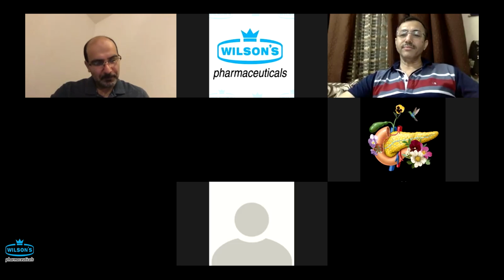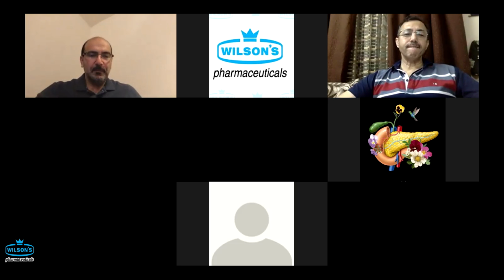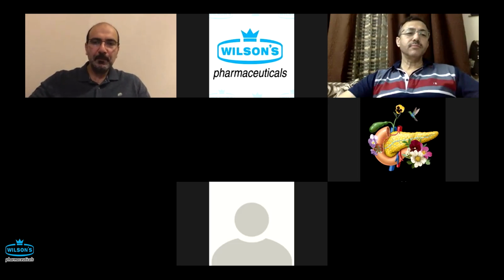And thank you so much for these kind words. Mustafa, that was a wonderful presentation, and I think you answered questions quite nicely. The one thing I would add, as an answer to the last question, is that when you are in D2, please do not lock the wheels of the EUS scope. That is very, very important.